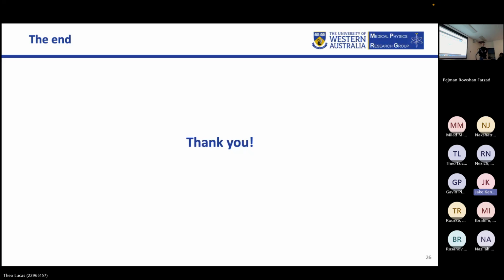Thanks, that was awesome. Do you reckon that lesion level cost function could be adapted into a sort of confidence metric that could accompany the lesion tracking, utilizing the cost function's output for each lesion? Well, if you take the variant that computed the fraction of overlap between lesion pairs, it's going to match a lesion as being the same, corresponding, if they have the maximum fractional overlap.